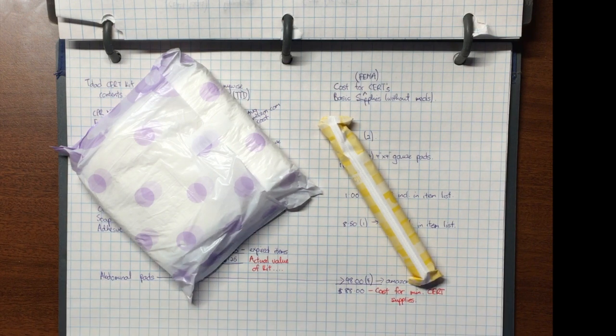I've seen people use feminine products, sanitary napkins and tampons, but there's a debate as to how hygienic and sanitary they are for this type of application.